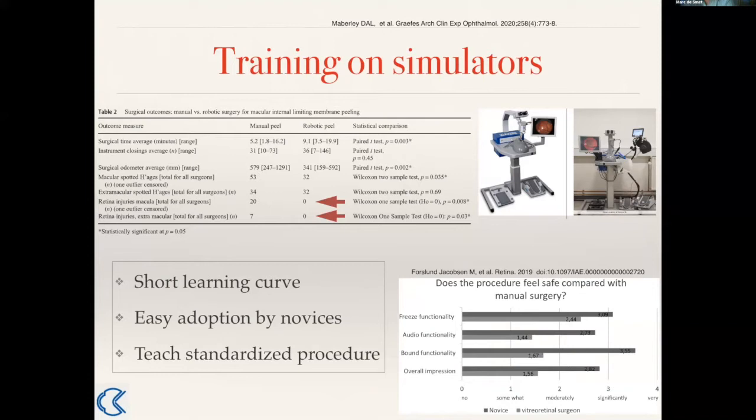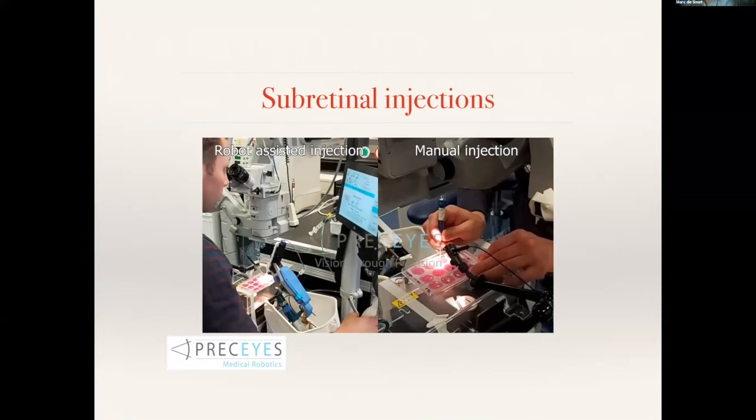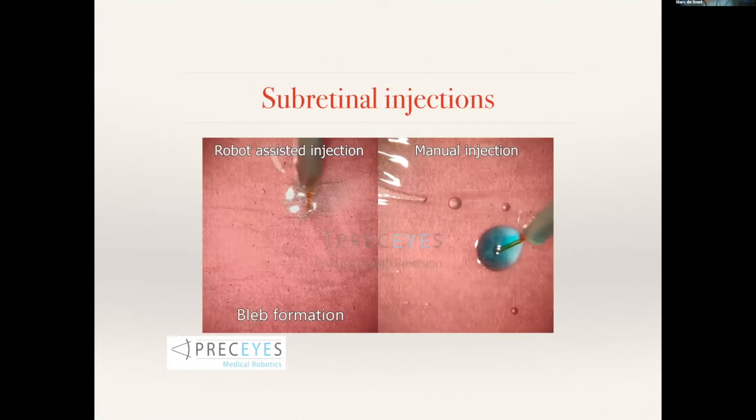And indeed, even though I've developed this, when I use this robot, I don't like the idea that it takes more time. I can do things faster manually, and I've developed the techniques that I need to do it. But there are certain things, for example, if we start to look at subretinal injections, and we have here a simulation that we've created again for Your Retina this past year, you'll see the difference on the right side between manual versus robotic. There's a lot more jitteriness and movement. This has to do with our own tremor. As we're trying to inject in this model under a sheet of paper, you are able to create a bleb using the robotic system, and it's much more difficult to do when it's done manually.